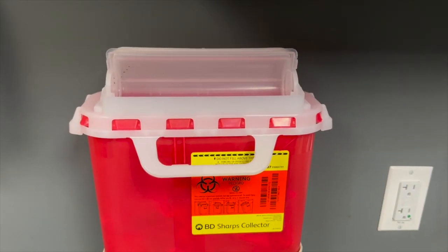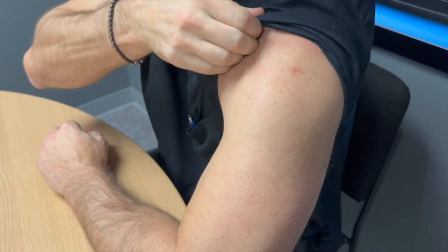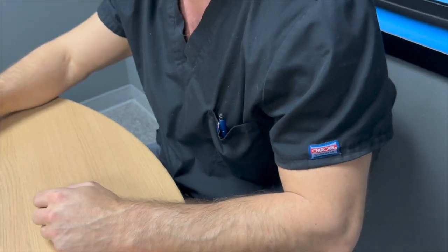Remove the needle and discard in a sharps container. You may want to swab the injection site one more time and apply firm circular pressure for a few seconds.